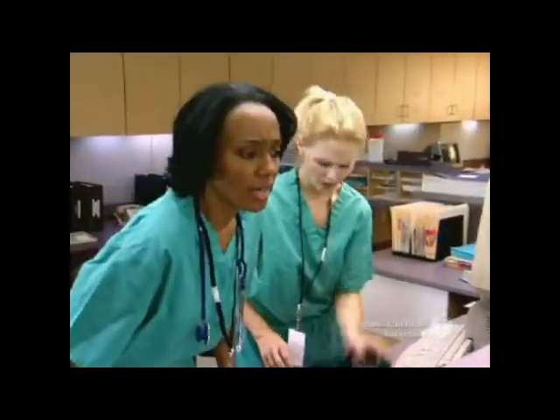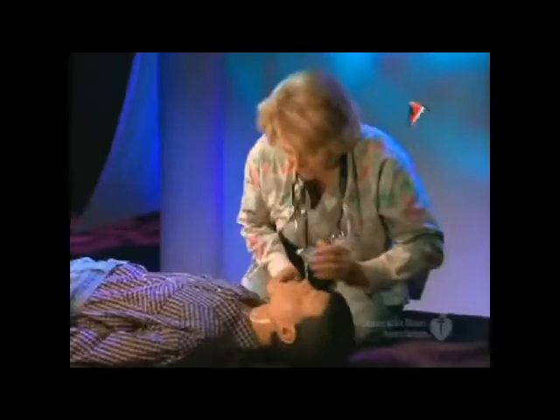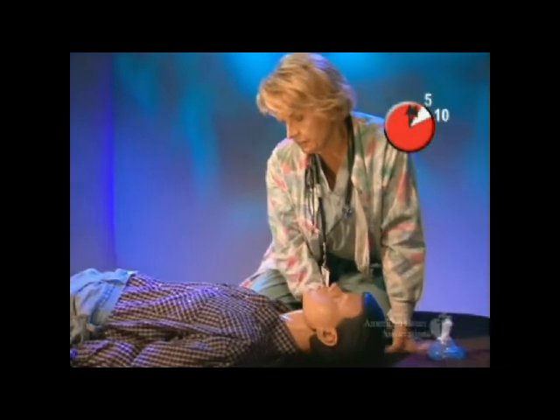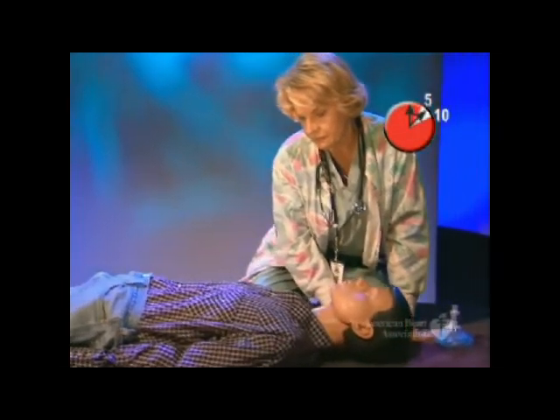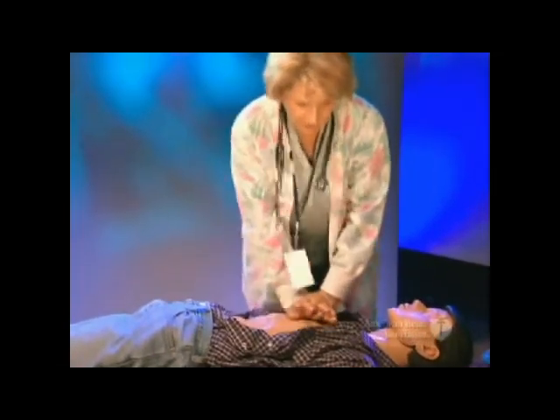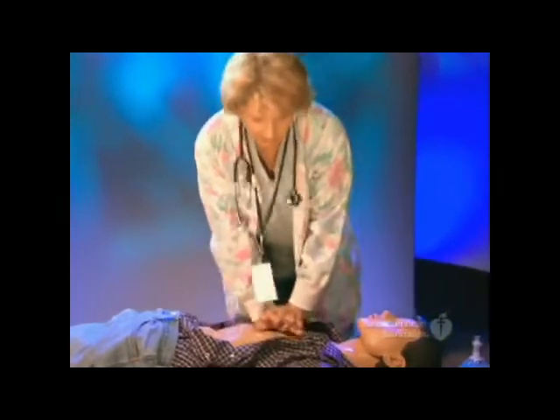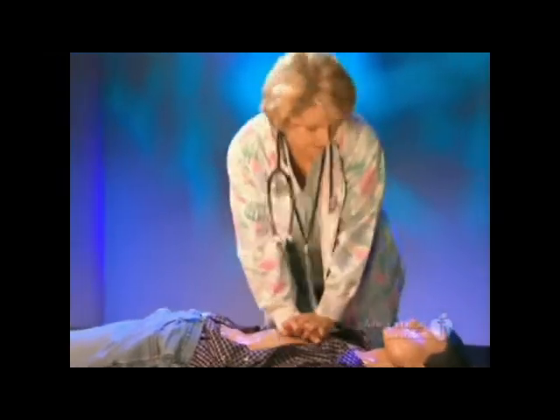While another rescuer goes to activate the emergency response system and get the AED, continue checking for a pulse. And if you do not definitely feel one within 5 to 10 seconds, quickly move or remove the clothes from the front of the chest that will get in the way of providing chest compressions and apply the AED pads. Provide cycles of 30 chest compressions and 2 breaths, and use the AED when it is available.